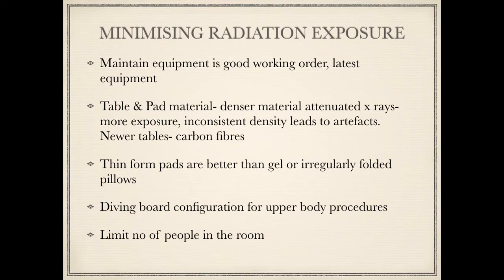So, basic things when we talk about minimizing radiation exposure: make sure equipment is in good working order. Obviously, having the latest equipment helps to minimize the radiation exposure, but that may or may not be achievable depending on the setup you're working in.